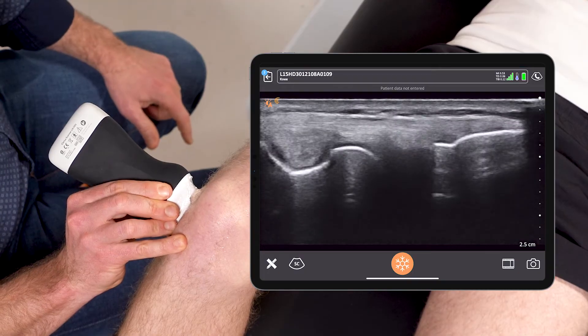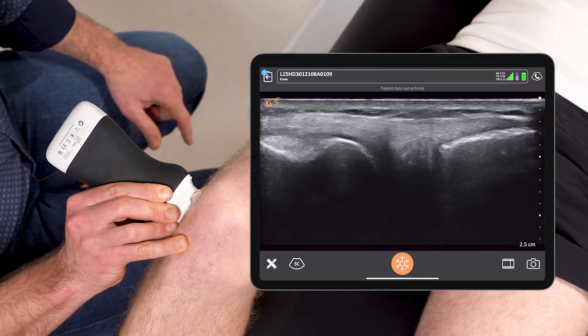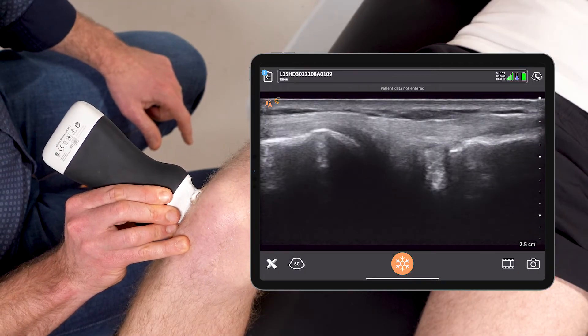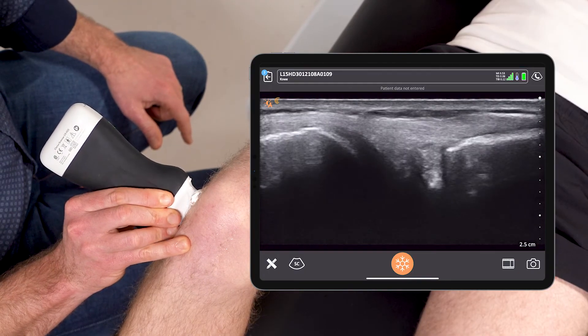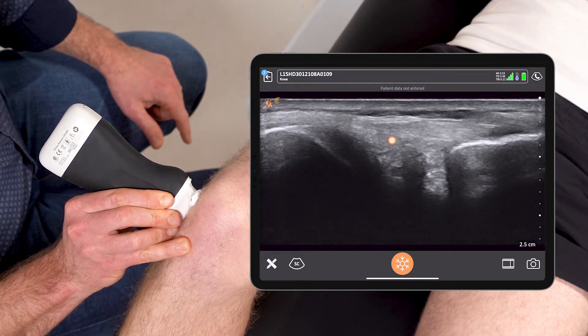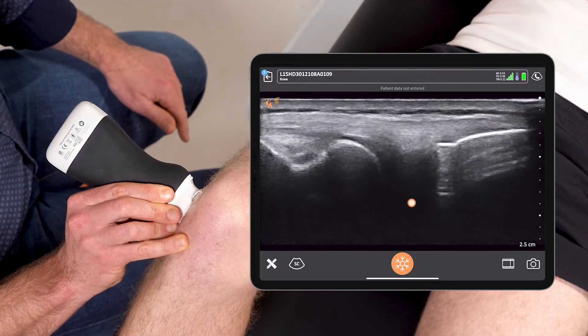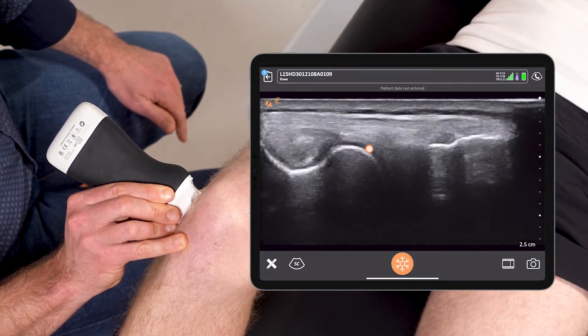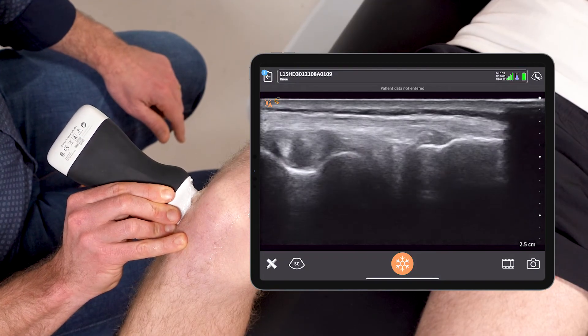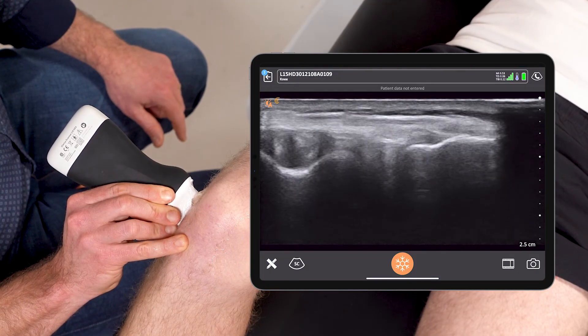And scanning through, once again I can look at the lateral meniscus trying to identify tears or fluid that isn't supposed to be there.